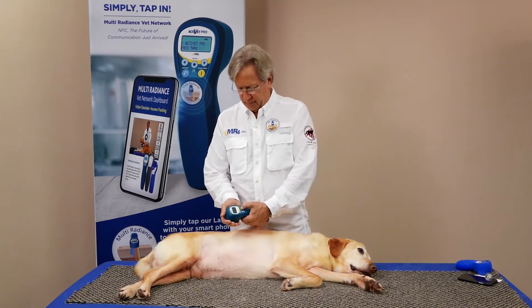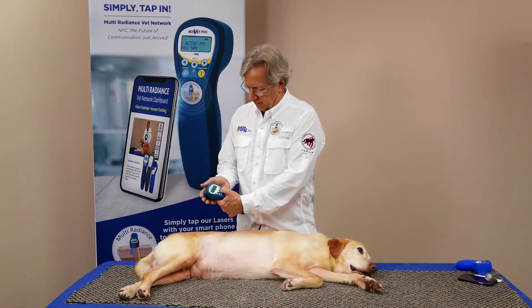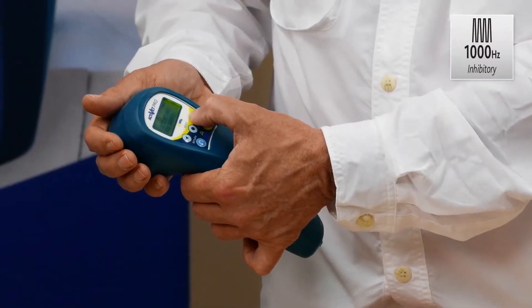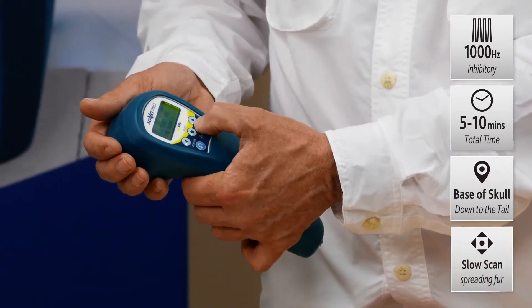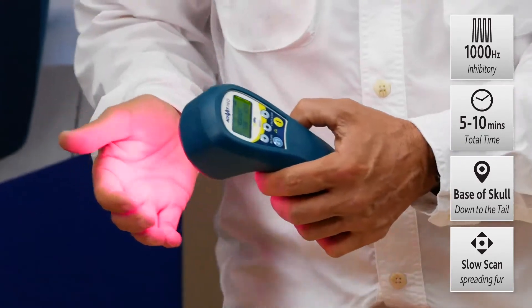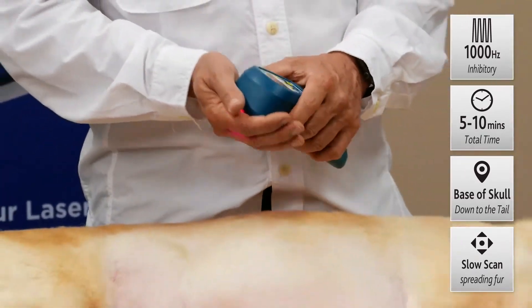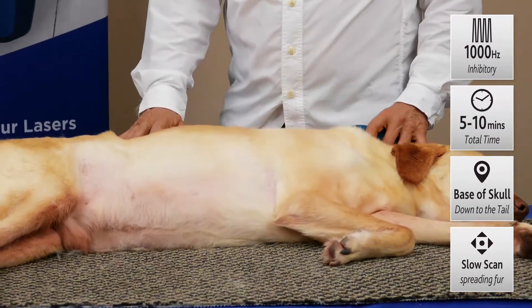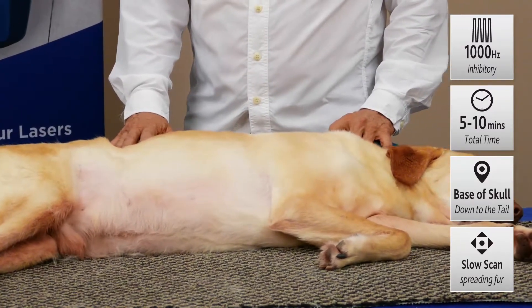We'll power up the laser with our hand over the front. We'll say no to the self-test, yes to the Activette Pro. The unwind protocol is at a thousand hertz — press select, then come up to three minutes and press the power button. You're seeing the red light flashing, you know that it's on. Then we just start at the base of the skull and scan down about a centimeter per second, nice and slow.